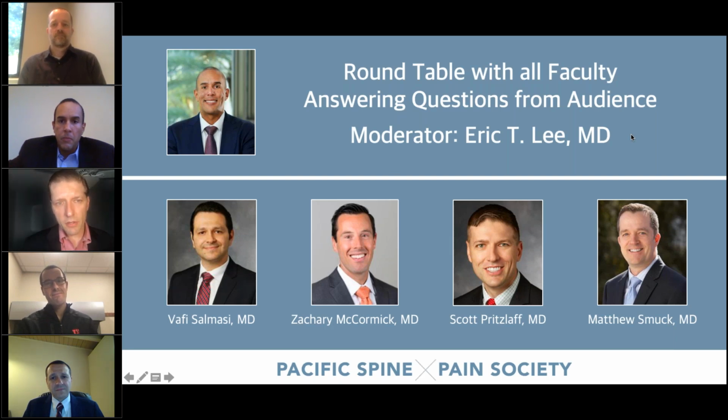The one thing I will say is I think size matters. I think the size of the lesion matters. So if you're not doing a larger bipolar, if you're using traditional cannula, it's really important to consider multiple ablations, because what we've learned in the past couple of years is there's an extreme amount of anatomic variability, and there's a robust network. To get them all, I even tell patients, if you get 50, 60% relief, that's a huge win. It's not going to be 100%.